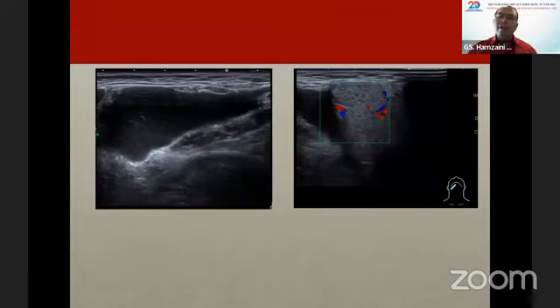So at the end, I thought maybe this is not a lymphatic malformation. When I did the ultrasound, I thought maybe this is actually a ranula cyst rather than a lymphatic malformation, because it's very close to the submandibular gland, and I can see a cleft here. So maybe there is a communication there.